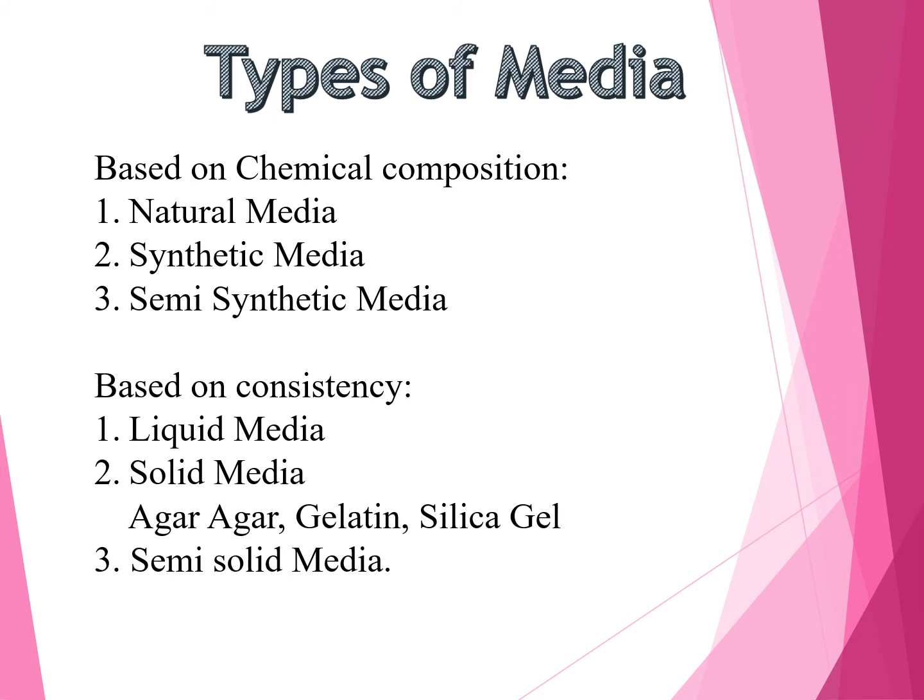Agar is chiefly used as an ingredient in desserts. Agar is an unbranched polysaccharide obtained from the cell membrane of some species of red algae such as genera of Gelidium, Gracilaria or seaweeds.